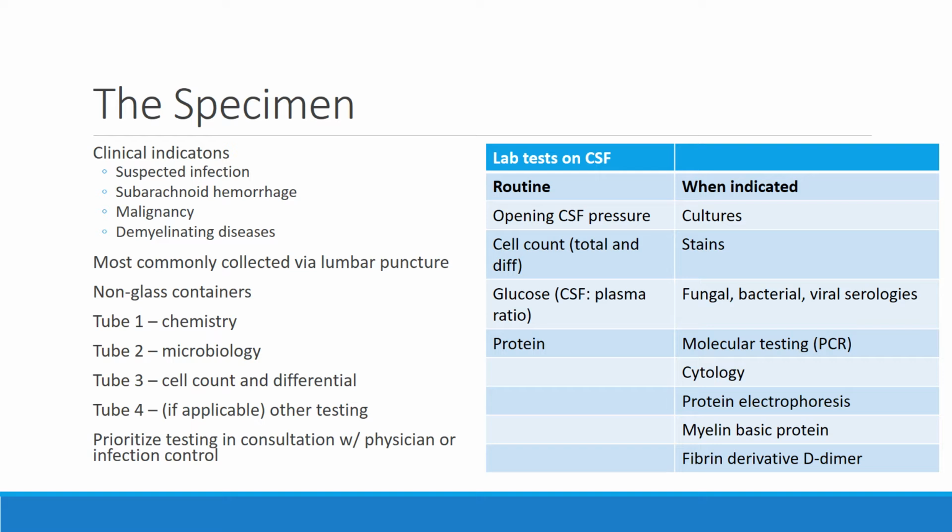These specimens should come down, and they generally do, in special plastic tubes. The tube is a conical tube, and it has a special base to allow it to stand up on its own. The purpose of which is really for the clinician as he collects the specimen. There are kits that the doctor opens.